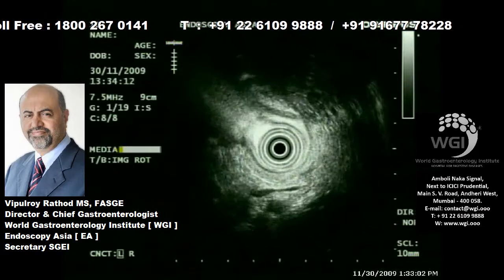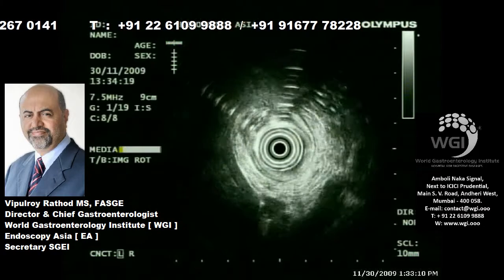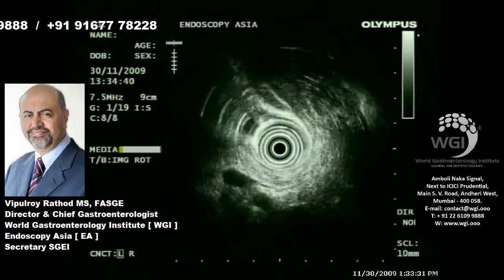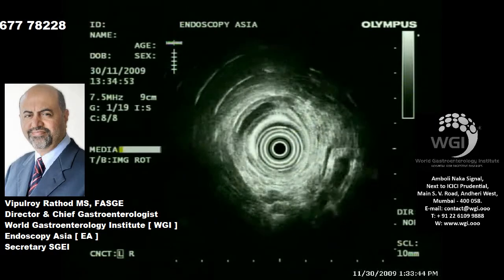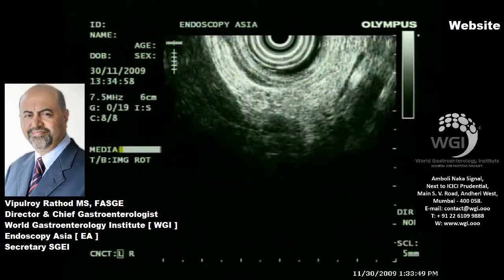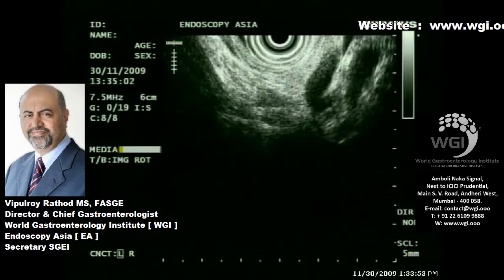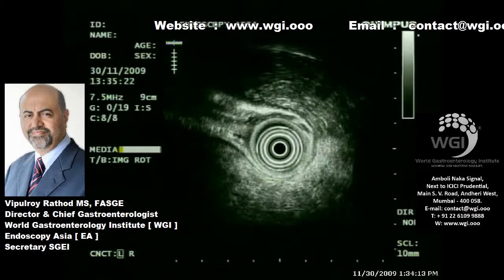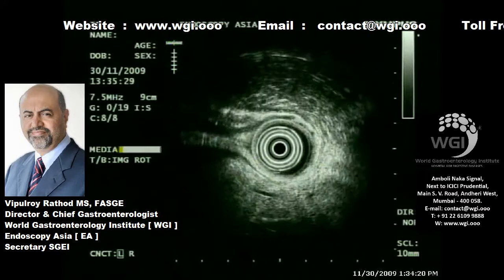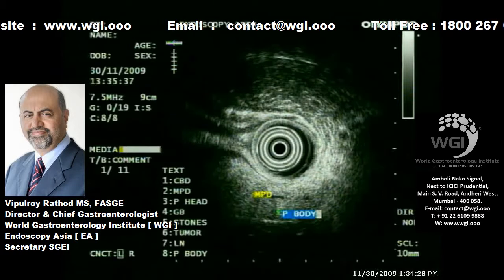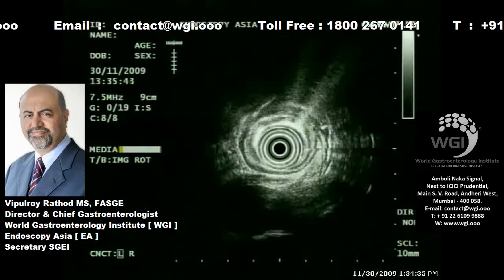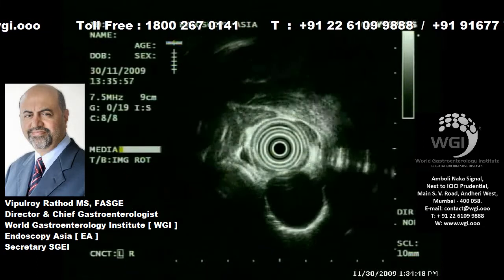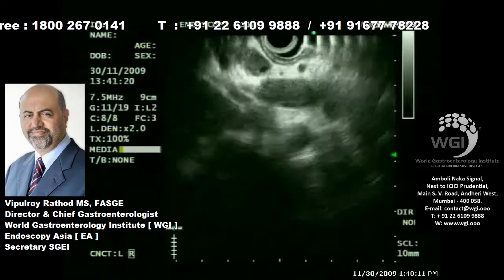The scope is withdrawn into the stomach and we are evaluating the celiac artery area where we can see a lymph node. This area is more precisely evaluated from just beneath the cardia level, and that station allows us to identify a lymph node in the celiac artery region. This patient has a node in the celiac artery. We are also seeing the pancreas and the pancreatic duct through endoscopic ultrasound — you can see the MPD running in the body of the pancreas. Endosonography allows us to see the primary mass, the peritumorous lymph nodes, the celiac artery lymph node, and also the supradiaphragmatic portion of the periesophageal region.